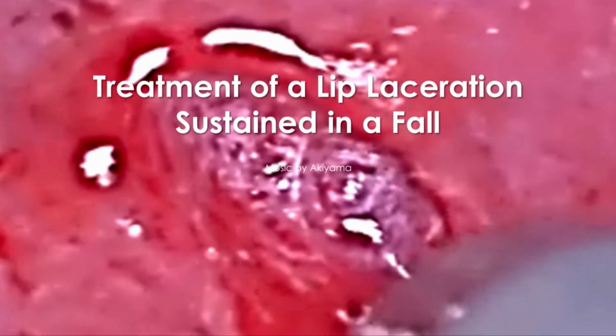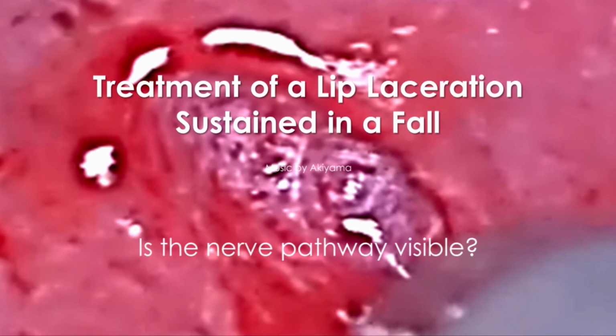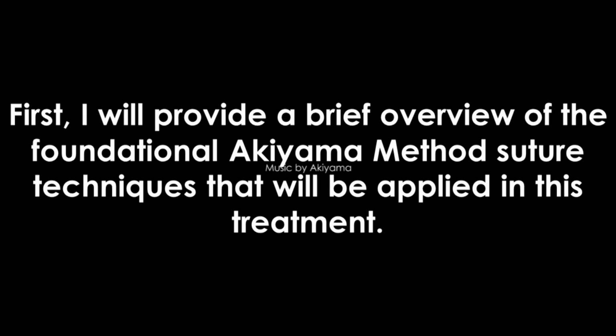Treatment of a lip laceration sustained in a fall. First, I will provide a brief overview of the foundational Akiyama method suture techniques that will be applied in this treatment.